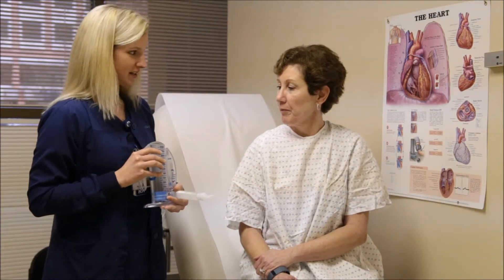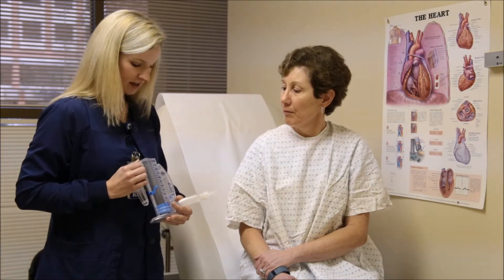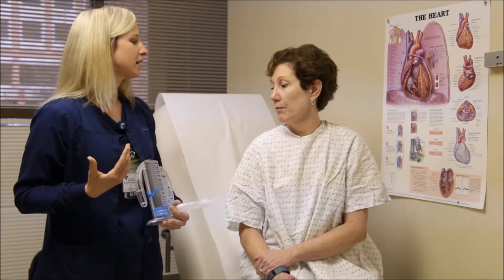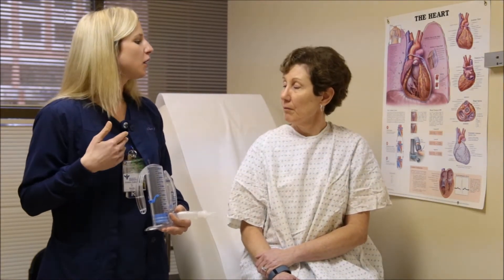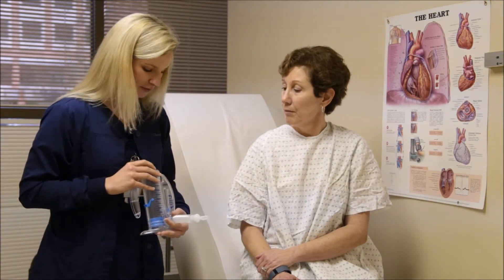So what this is, it's a breathing tool that we use, and what it does is it helps to expand your lungs by helping you take deep breaths. It can also help you cough if you have any drainage or something that you need to cough up.